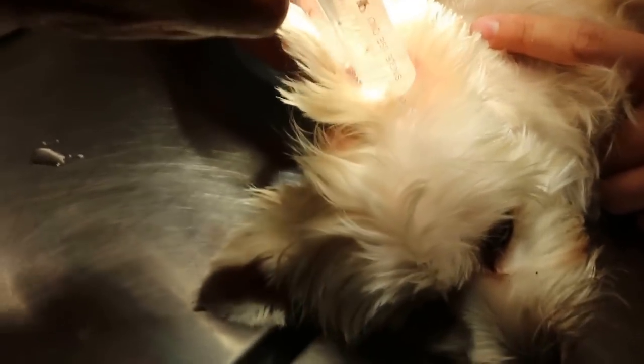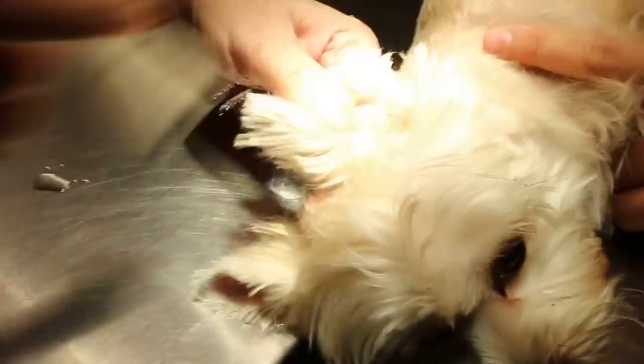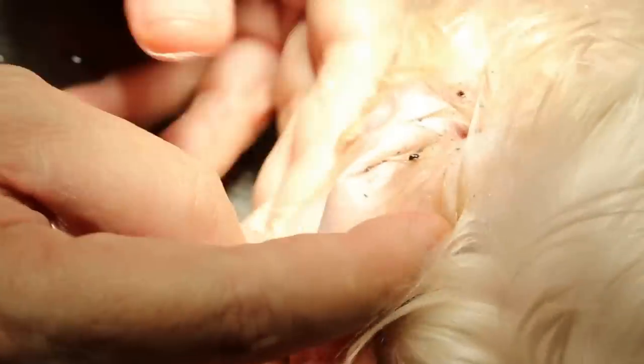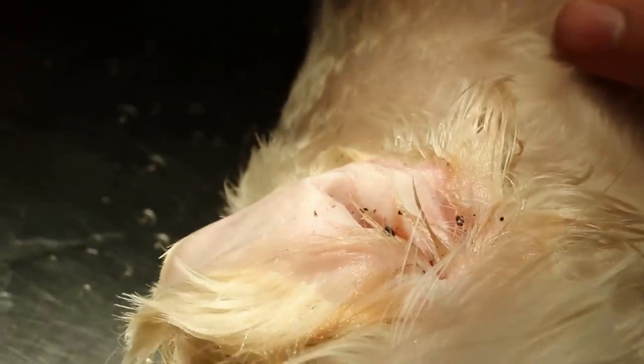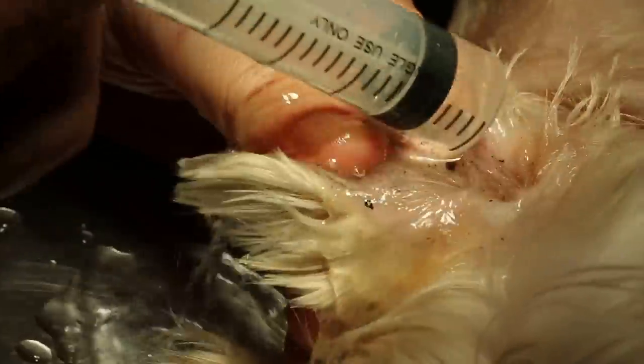Normally the dog should be down on this side first. Position the nozzle at 45 degrees to the ear canal. You see the dirt coming out. That's why you need to sedate the dog — because if you don't, you definitely won't be able to do a good job. Okay, more dirt coming out here.